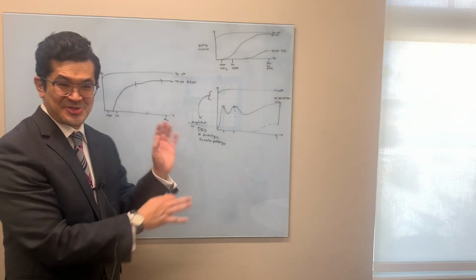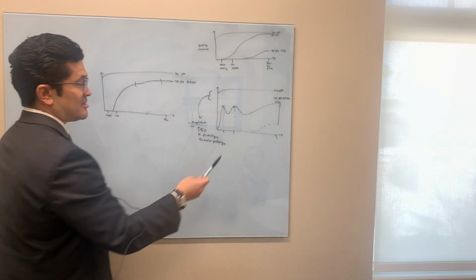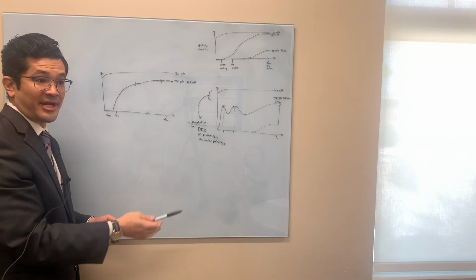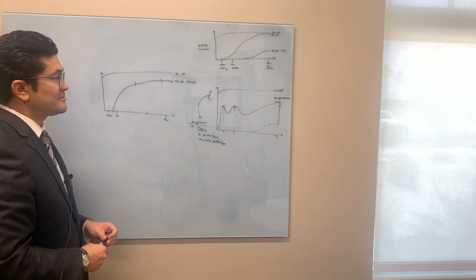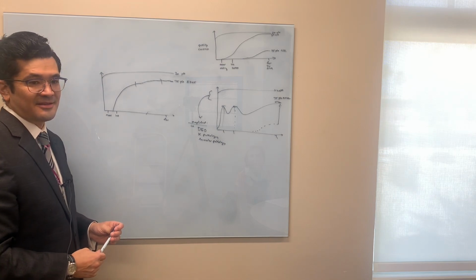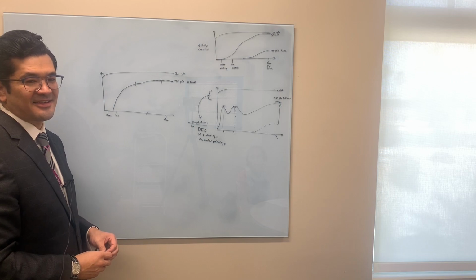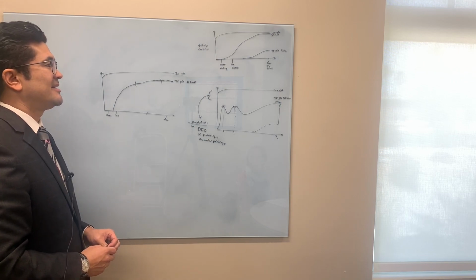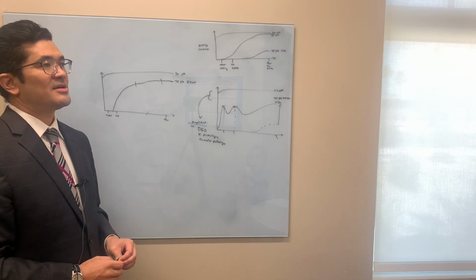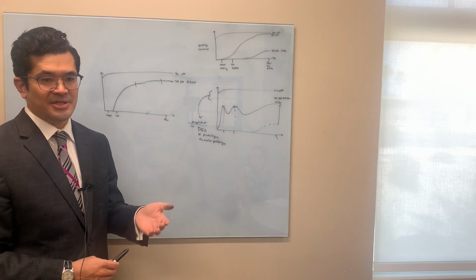And these are the broad categories. So do we do a monofocal, multifocal, extended range like Vivity? So the younger patients, the 50-year-olds, the pilots and so forth, do they get best results with the basic? Right. So how do you manage this? Well, you really have to look at the patient.